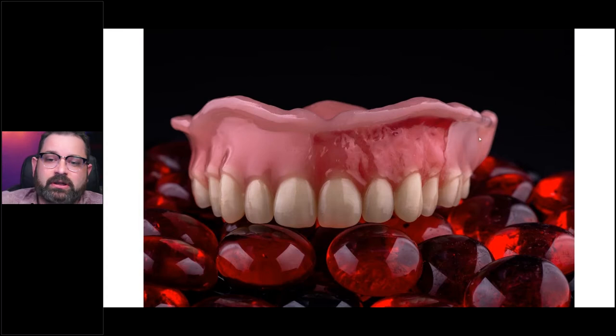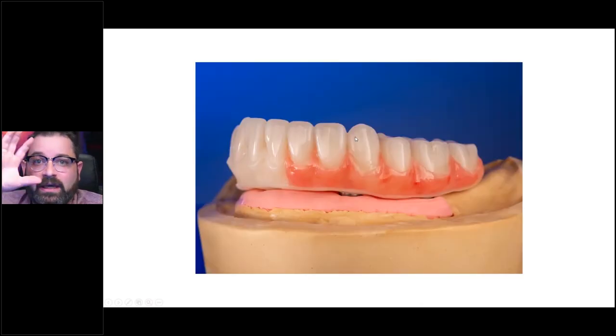With this particular restoration that we're starting with, this was a digitally fabricated restoration, but the teeth utilized here were carded teeth. So the base was printed and the reduction was done digitally on one area, and the teeth were actually cemented into the base. It doesn't matter if you do it on this type of restoration or, for example, a completely monolithic restoration where you also did the cut back digitally and just refined it by hand. The application is very similar.